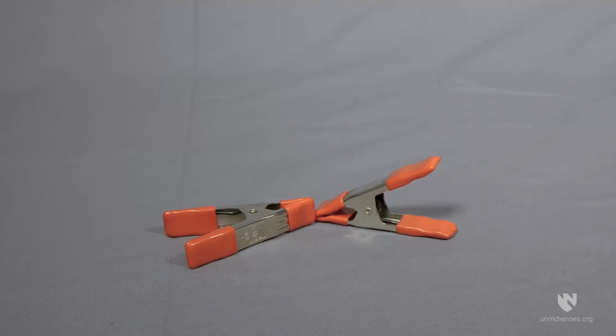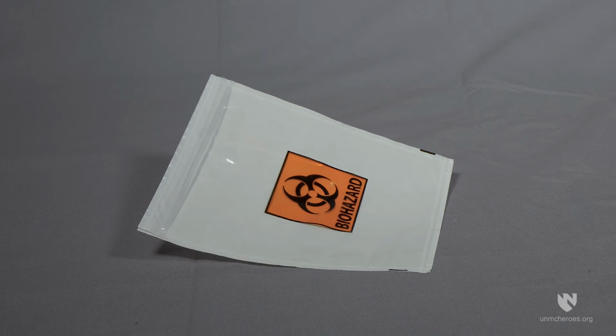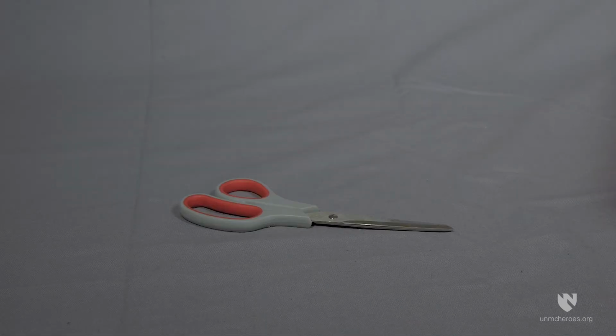One item that is not supplied with the portable system that you would find in the facility system is a retaining clip. We recommend that you require one for the portable system, as this will help to keep the BioSeal material aligned as you seal it. 3 identification tags, self-adhesive biohazard pouch, scissors for trimming excess material.